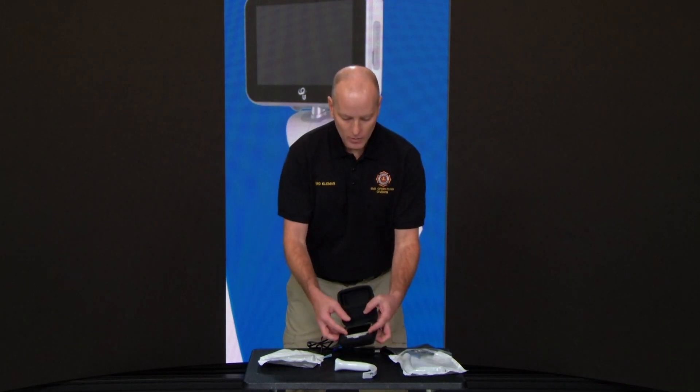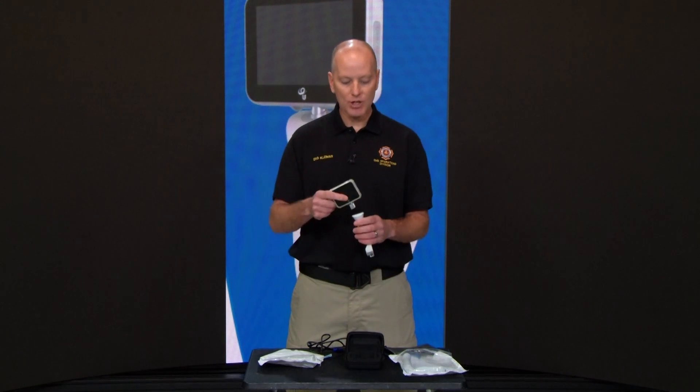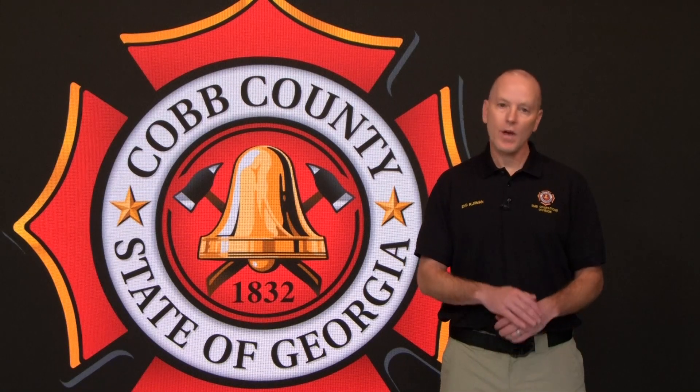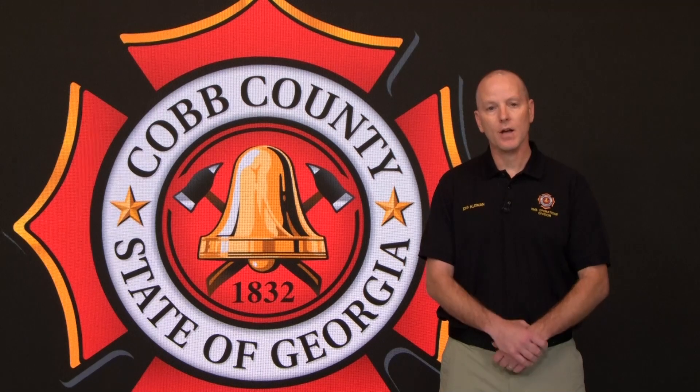When taking your UE Scope out, it has to be attached to the blade before you turn it on. If you have any further questions or want additional training, please reach out to the EMS Operations Division.